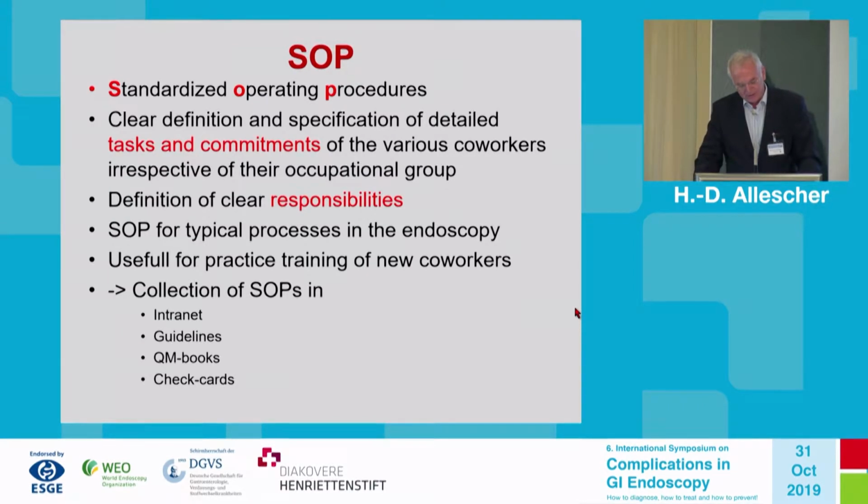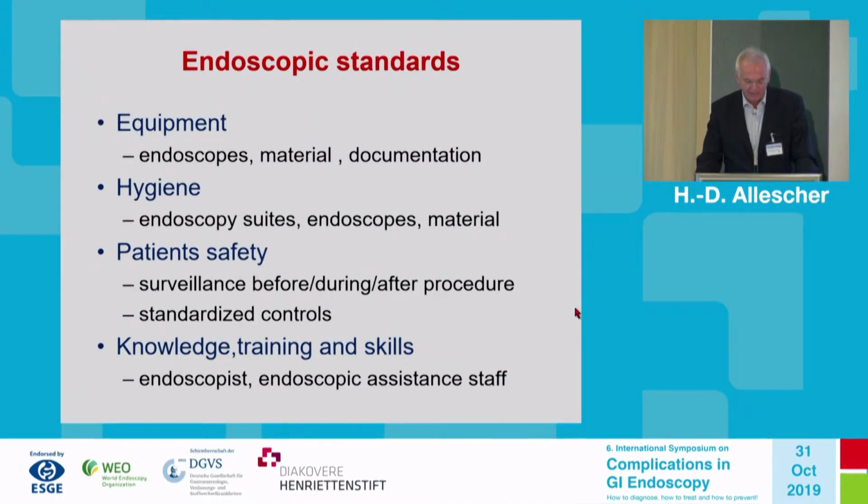And then it is important to define SOPs for the typical processes in endoscopy, like upper GI or lower GI endoscopy, but also for the more specific procedures. This is extremely important for the all-day work, but it's also very important if you train new co-workers and if you introduce new techniques. Then you should collect all these SOPs so you can find them, so that you don't have them only in a folder somewhere in your office, but everybody can access it. In the meantime, it's usual that you post it in your intranet or in your guideline book, that you print some check cards, as I will show later on.